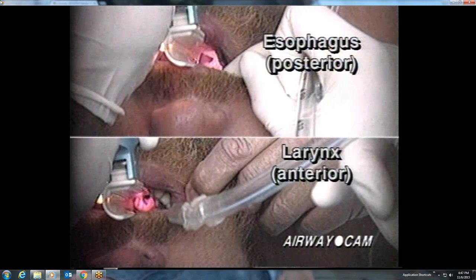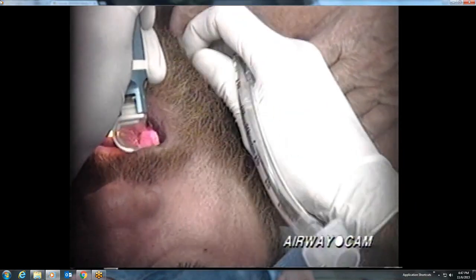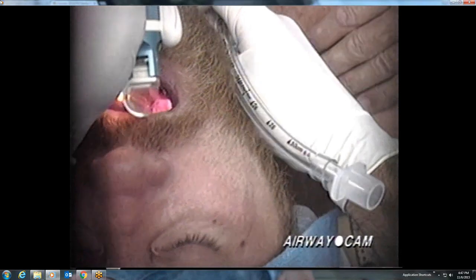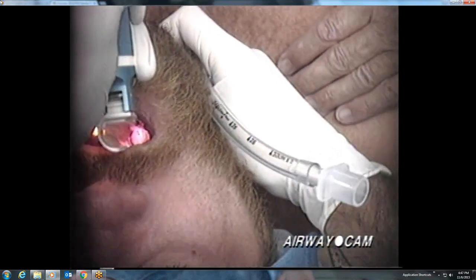As already discussed, the true vocal cords are often not well visualized during direct laryngoscopy. Recognition of the posterior cartilages adjacent to the glottic opening is a consistently dependable landmark for identification of the entrance into the larynx. In slow motion, let's take a repeat look at the use of laryngeal manipulation by pressing on the thyroid cartilage on the anterior neck.